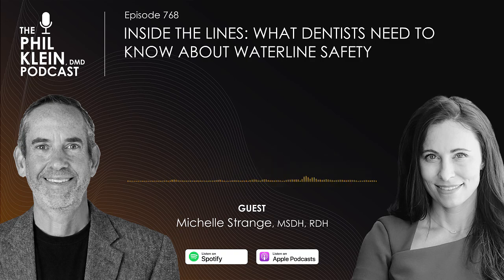So for instance, if I'm still in that Stericyl Citrasil situation, I will dump the Citrasil from the water bottle the next day. I will fill it with my tap water that I use on my unit, and then I will put it back on and run those lines again. I usually go about 1 minute to 2 minutes. You always want to make sure you clear all the orange first, and then I go about a minute after that personally. But you could go as long as you want. But after that orange is gone and you've got some water flushing through, you're usually pretty fine with it. So, then you're good to go.